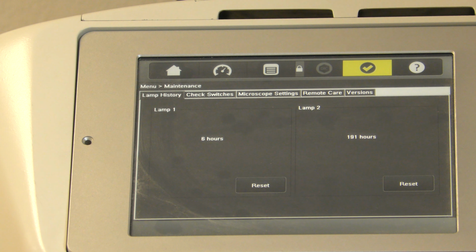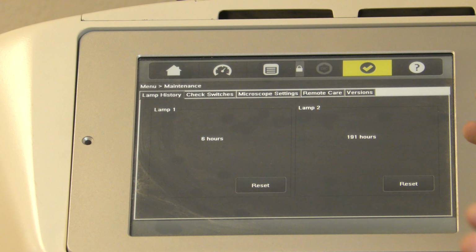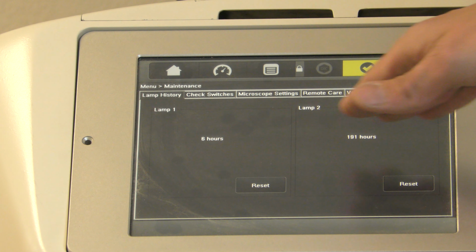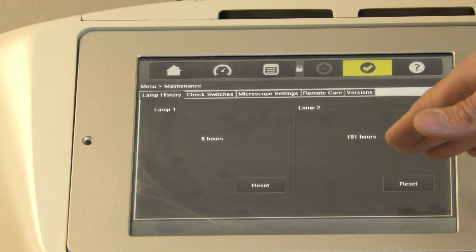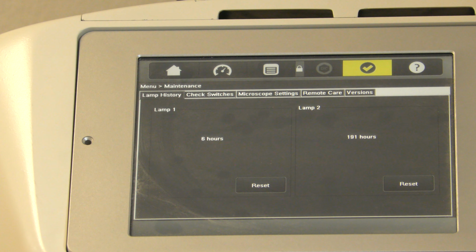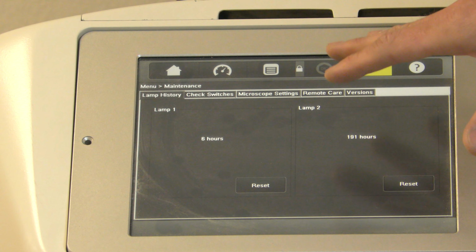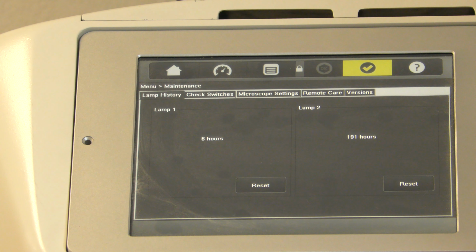or the hour counts are really high, then it's immediately I change them. There's no question about it. But typically you don't see that the hour counts in the database are high. You usually see something weird like this, where you see 6 hours even though you know that's an old bulb. That's strike 3. So strike 3 is if there's any sort of discrepancy between the bulb timer and the bulb timer here in the database, then I make sure to replace those bulbs.